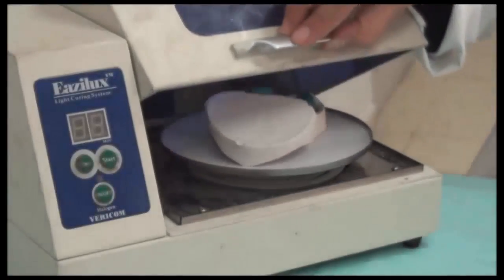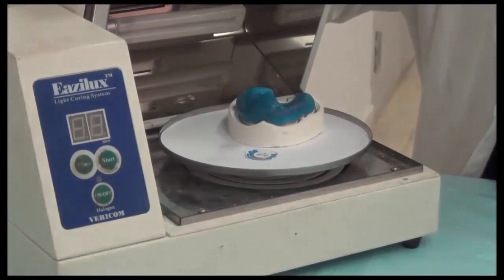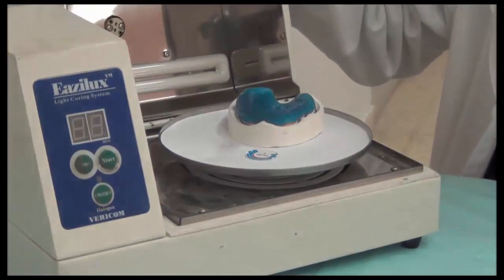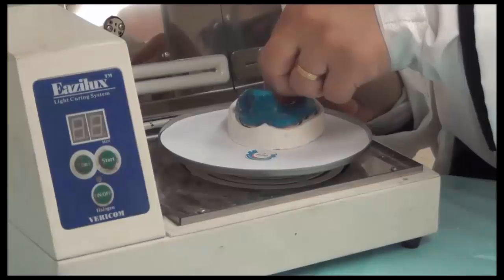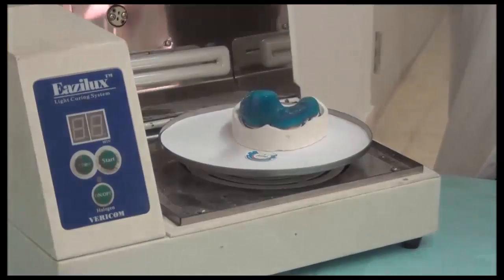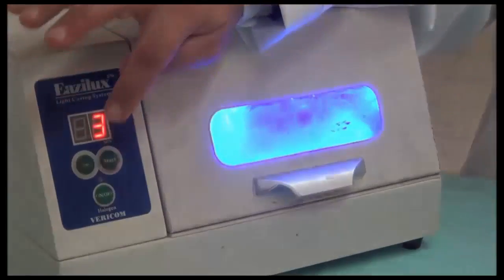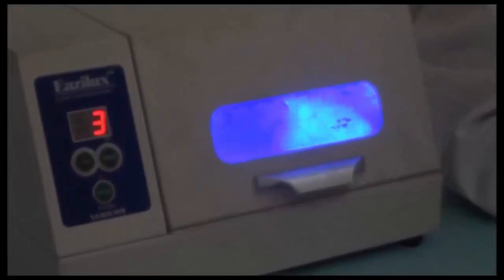At the middle of the cycle, I could open this and remove the support I was placing, because the support will be preventing the light from reaching some parts of the cast. As well, I'm removing the opaque layer that I placed on the palatal side to expose those areas now, and it could continue its cycle. We're going to wait for the 3 minutes to finish. Then we are going to open it, take out the tray and the cast, separate them, and put the tray alone for the fitting surface.